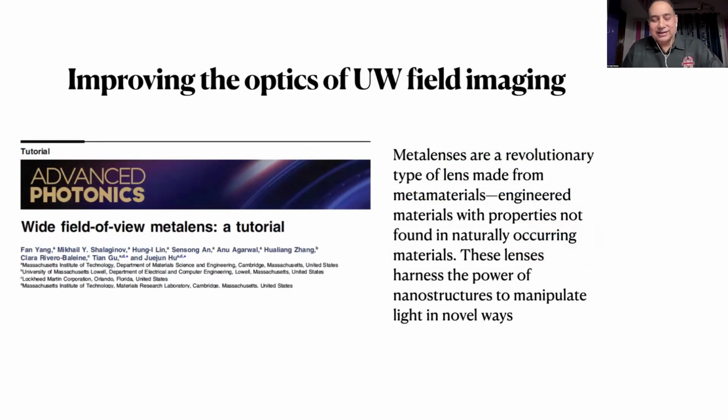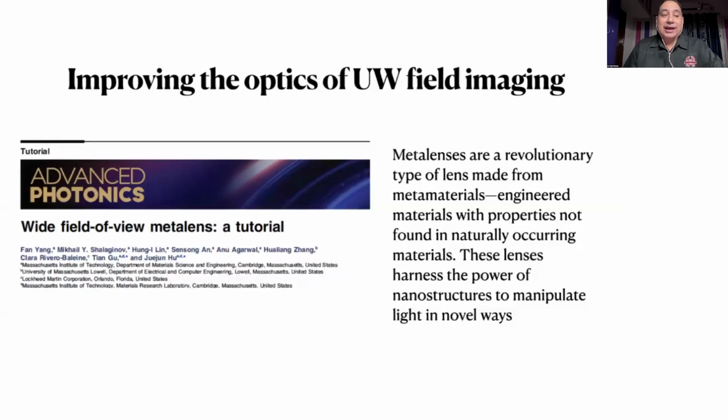Traditionally, these ultra-wide field systems have an array of lenses, some prisms, so that the peripheral retina could be visualized. And that makes the peripheral view a bit hazy as compared to the central view. Meta lens is something which has been used in other specialties, other domains. It's made up of metamaterials, which are actually nanostructures, and they are thin lenses which can really be used to improve the quality of the image. There is research happening to integrate these meta lenses into ultra wide field imaging.